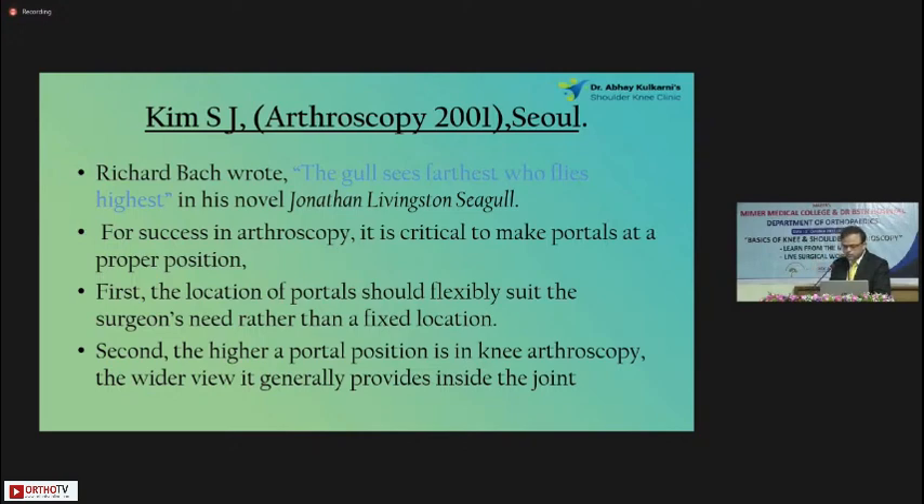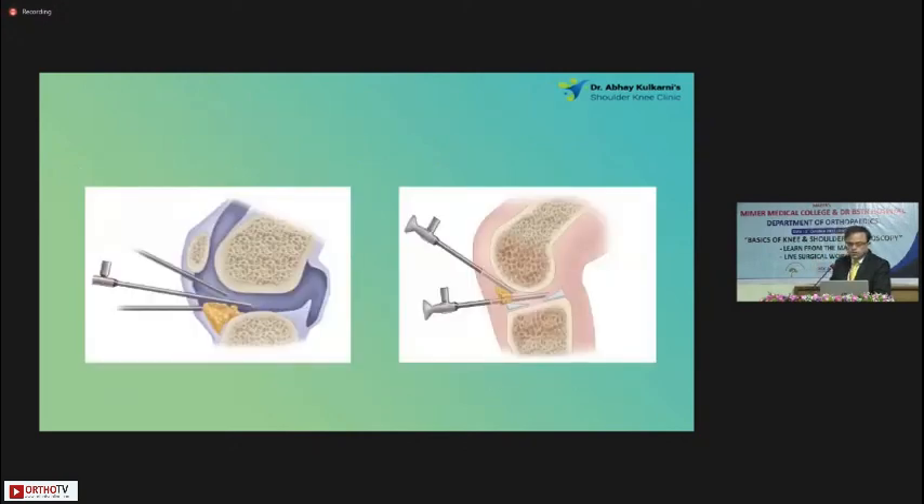One needs to remember that. Here is a demonstration — this is a very low portal, and as you see, it is getting stuck in the fat pad. This is a very high-riding portal; negotiating around the knee would be difficult. So the standard high anterolateral portal should be the viewing portal — this is what I use.